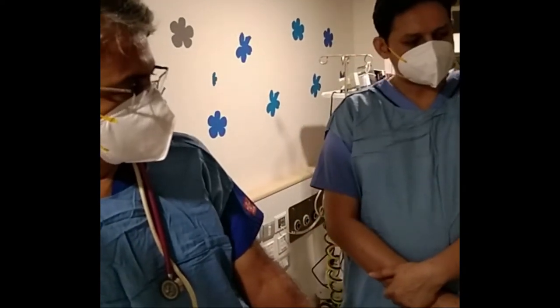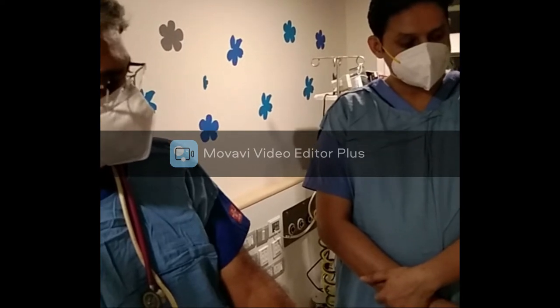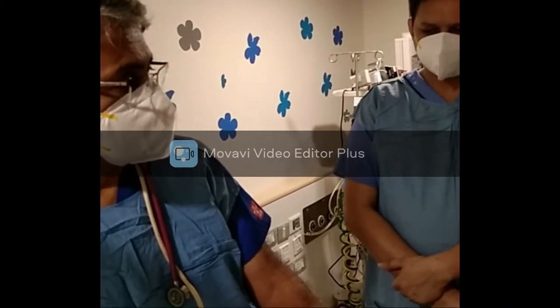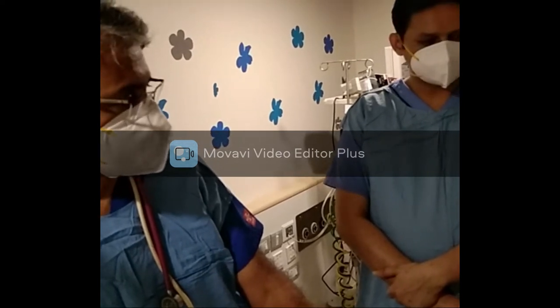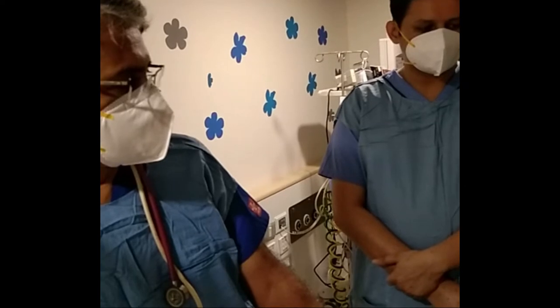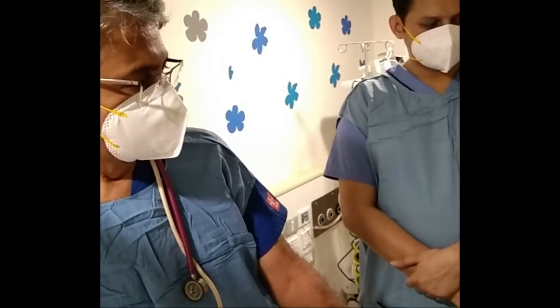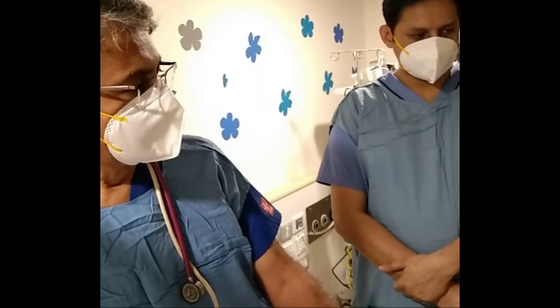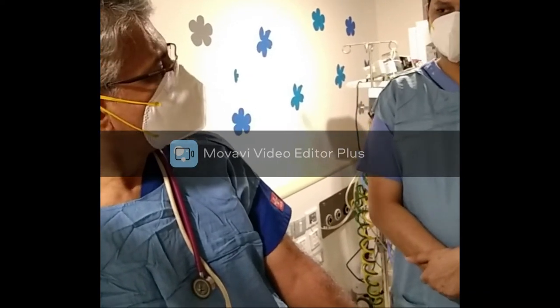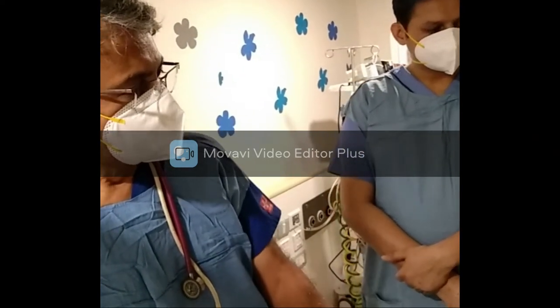Other parameters that can help in deriving ventricular function are MAPSE, that is mitral annular plane systolic excursion. The other two parameters are global longitudinal strain and ejection fraction using the Simpson biplane method. Each one I'm going to explain.